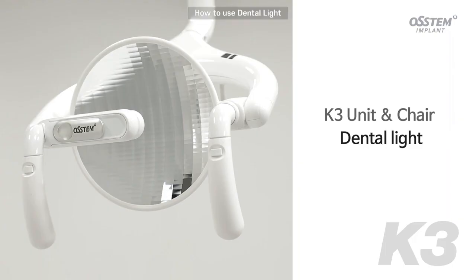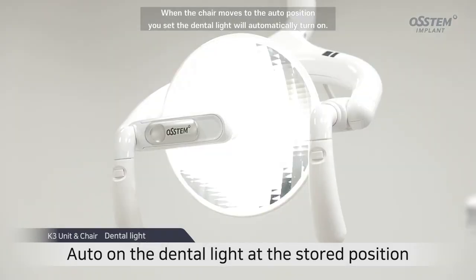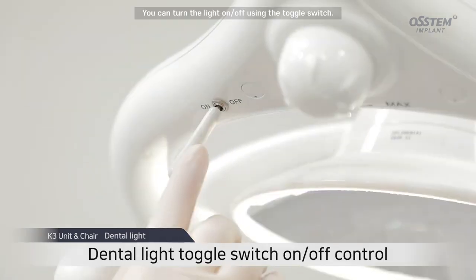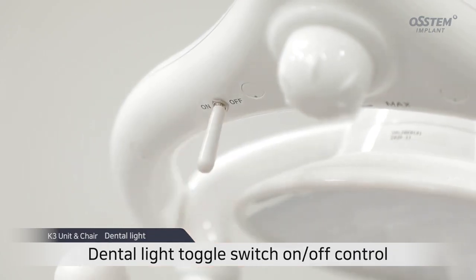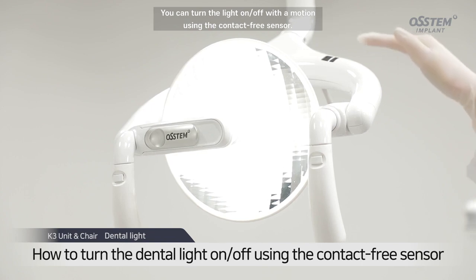How to use the dental light. When the chair moves to the auto position you set, the dental light will automatically turn on. You can turn the light on or off using the toggle switch. You can turn the light on or off with a motion using the contact-free sensor.